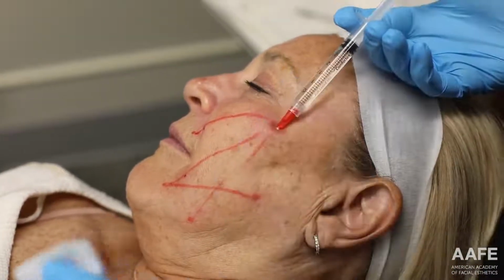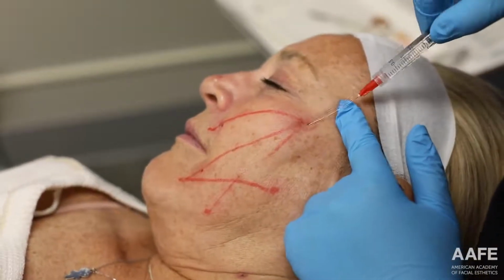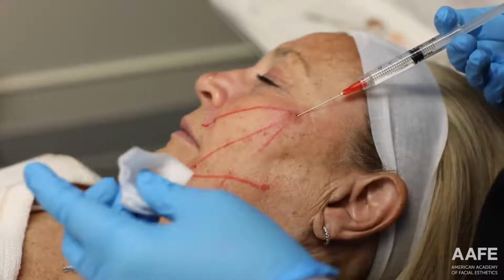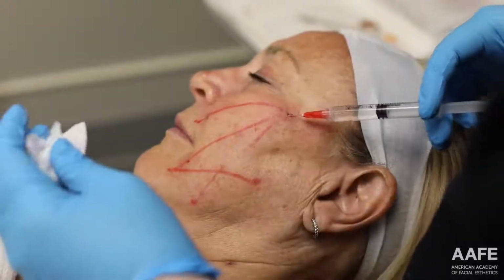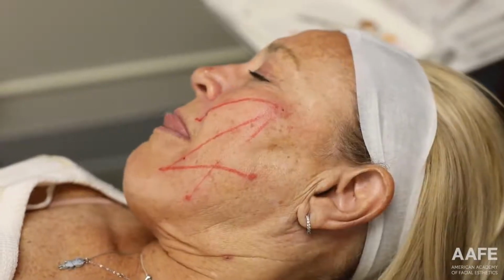Once you're in that correct plane, you can see how I'm just gliding through. Some of those little resistance that I'm meeting is completely normal. If you were too superficial, you would be meeting a lot of resistance. So just kind of keep that in mind. Like if you're really struggling to get through the tissue with your cannula, you might just be too superficial.